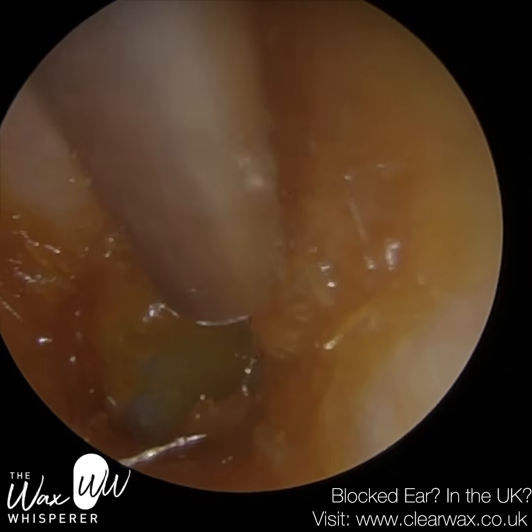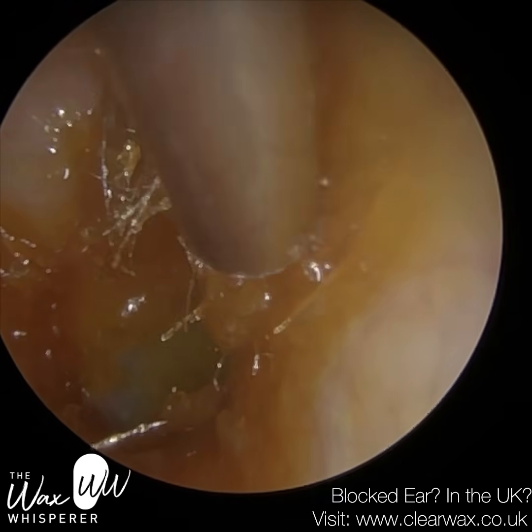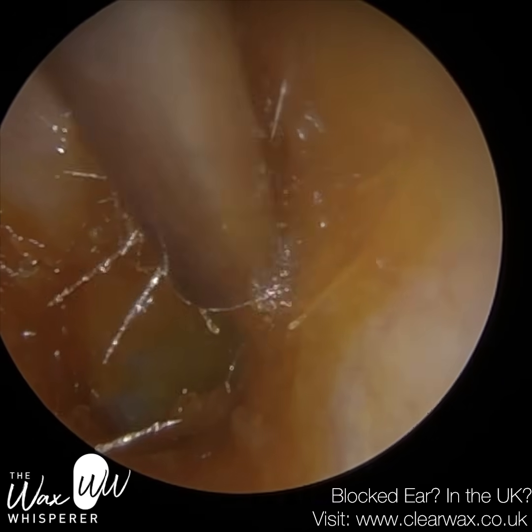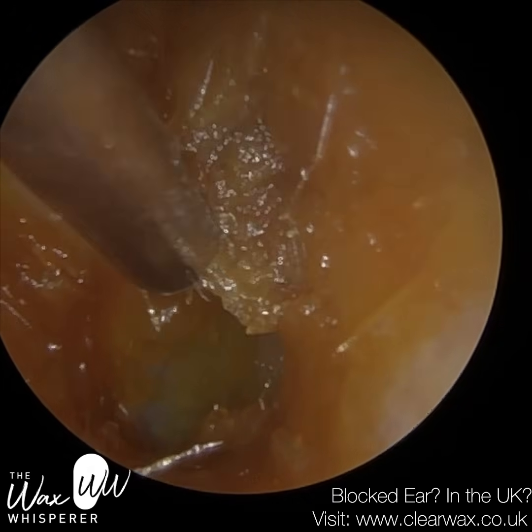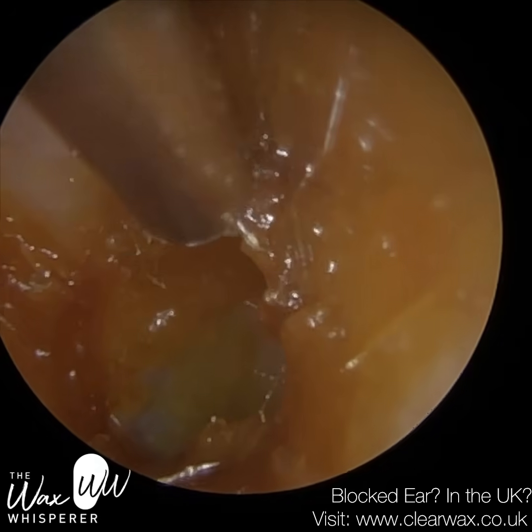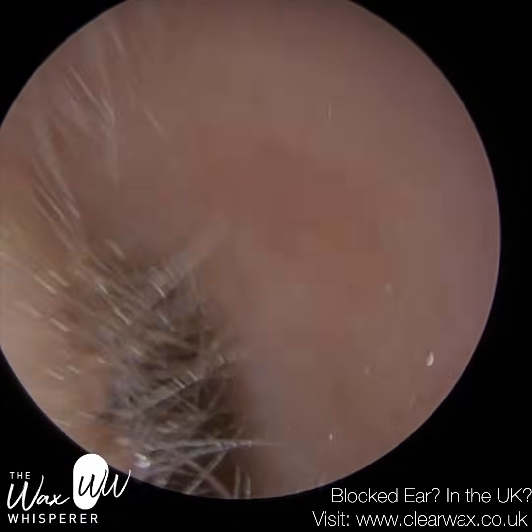And the reason why I recommend olive oil is with earwax, once you've got occluding earwax, whichever drops you use, it's not going to dissolve the wax. That's the misnomer. You may see it on packaging that it dissolves the wax. Nothing is going to dissolve wax. For me, the word dissolve means it disappears. Now, it can break down wax, so you can disperse it and break it down. So drops like hydrogen peroxide drops, sodium bicarbonate drops, but it's still going to be in your ear. It still needs to be removed.